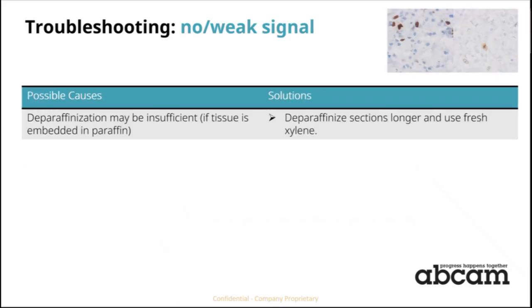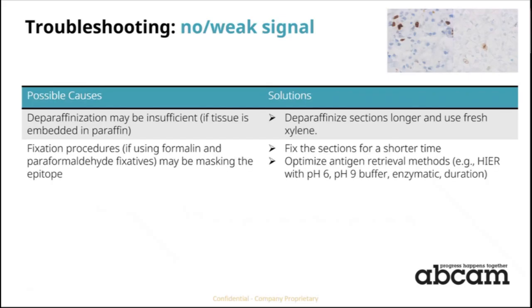And if you are working with paraffin tissue sections, you will need to ensure that the sections are completely deparaffinized so that it does not interfere with staining. The fixation duration might also need to be optimized to prevent over-fixation of the sample, which may mask the antigen.